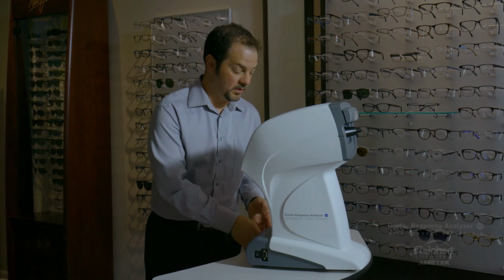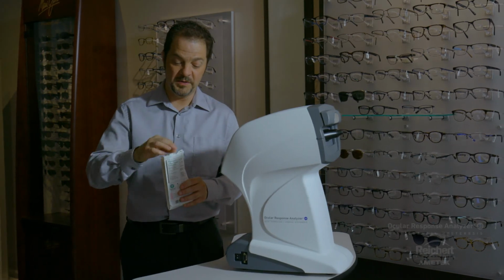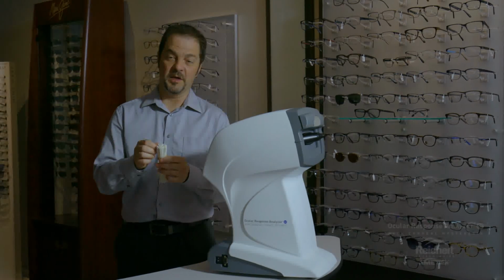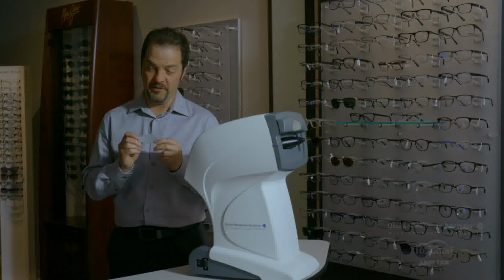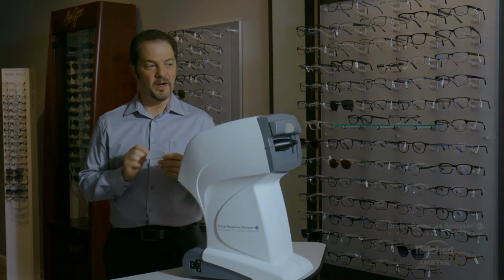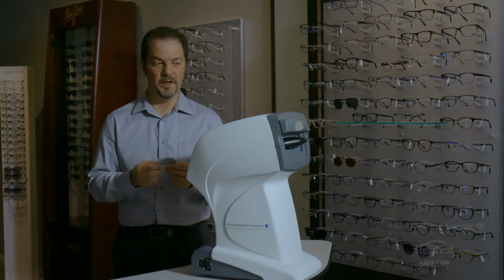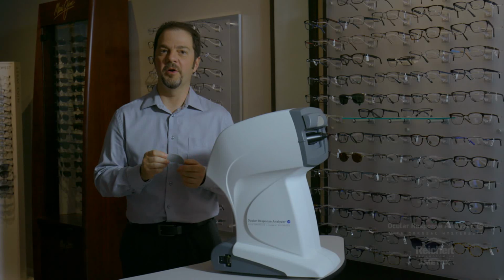Now the instrument comes along with a little cleaning kit. We ship you a package of long-handled cotton swabs that you can use to clean some of the windows on the instrument, and we ship some pipe cleaners that can be used to clean the air tube on the instrument. In addition, we ship it with an extra forehead rest pad. If the forehead rest on the instrument becomes too dirty and just doesn't look good anymore and you can't clean it, this just pulls off and goes back on with no adhesive necessary or anything else.